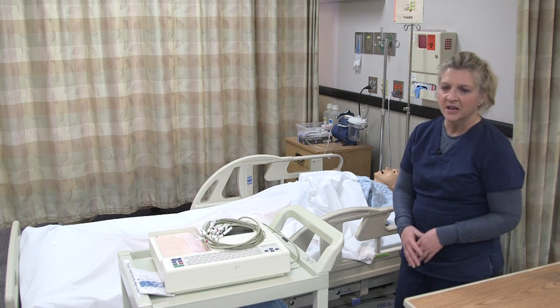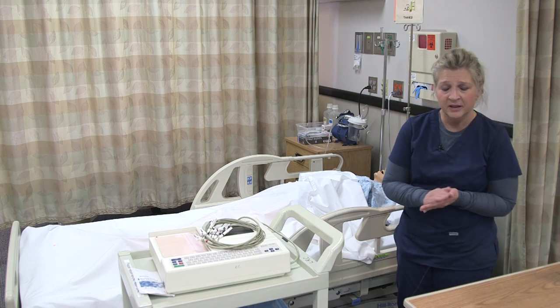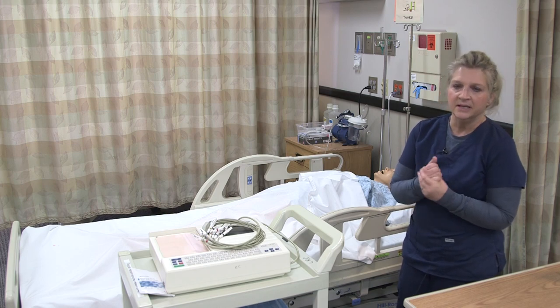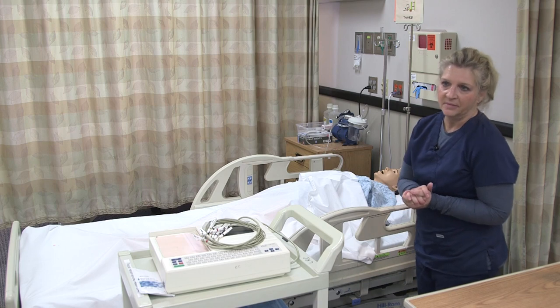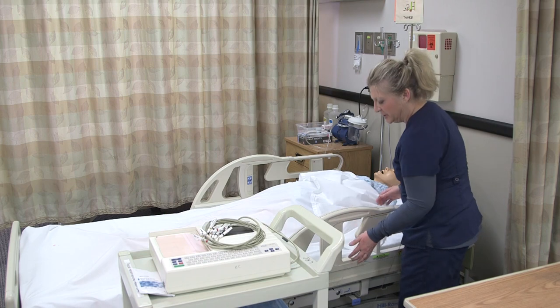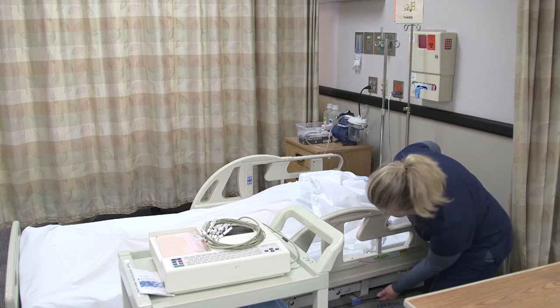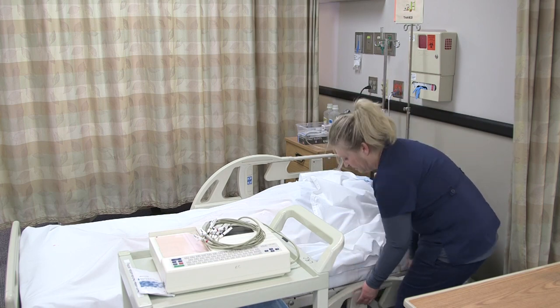So as always, I enter the room and I'm going to be washing my hands. I'm going to be introducing who I am, providing privacy, and also verifying the identification on my patient using two identifiers. When I come into the room, I'm going to tell the patient that we are going to be doing an EKG — an electrocardiogram — which measures the electrical activity of the heart.